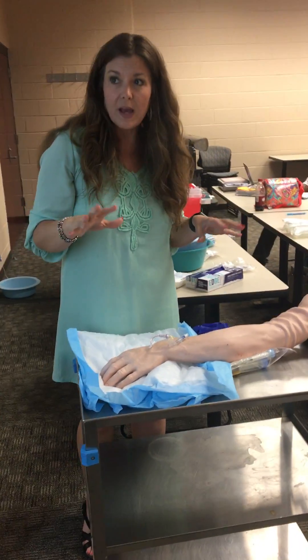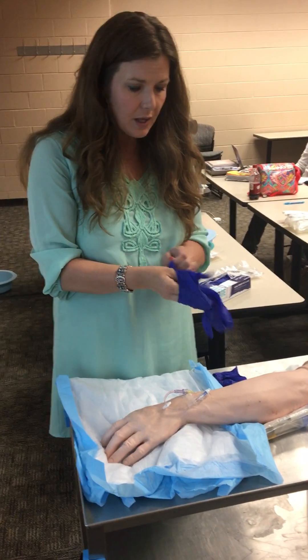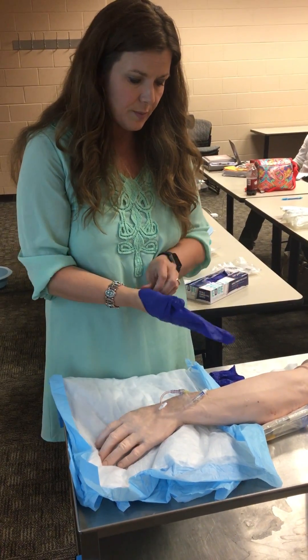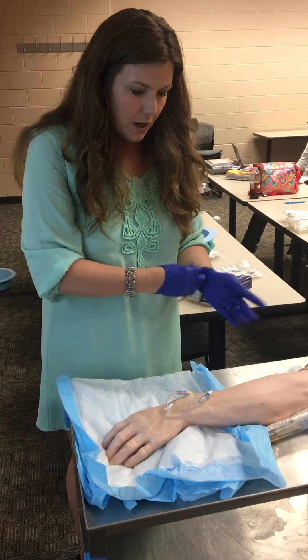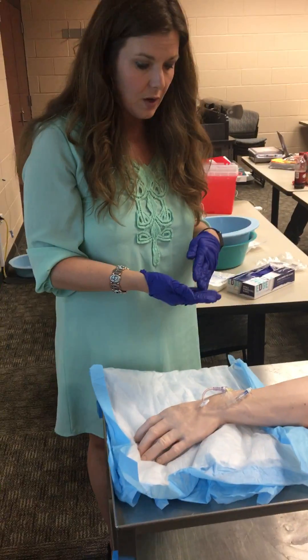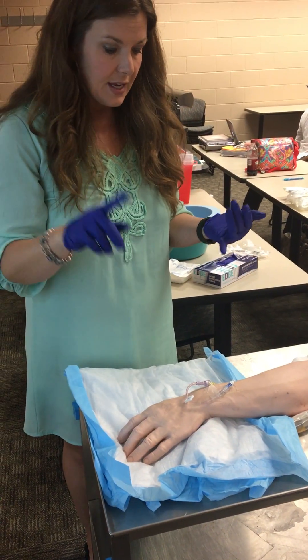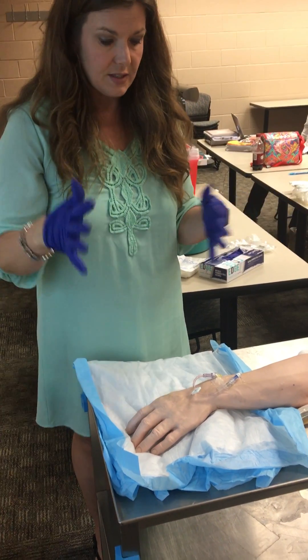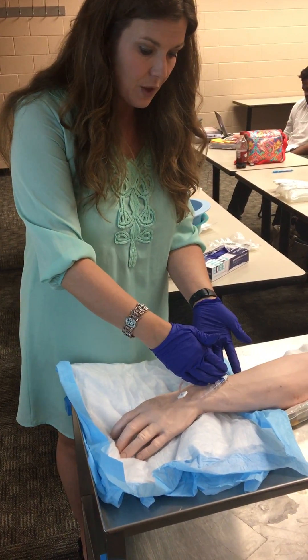You checked your rate. The next part is assessing for patency. I'll go ahead and put on gloves — you don't necessarily have to, but if you're going to be touching the patient, go ahead and put gloves on. Patency just means that it's flowing. We would have an IV hooked to it, and you're confirming it's dripping in — nothing stopped, no signs that it's not flowing.